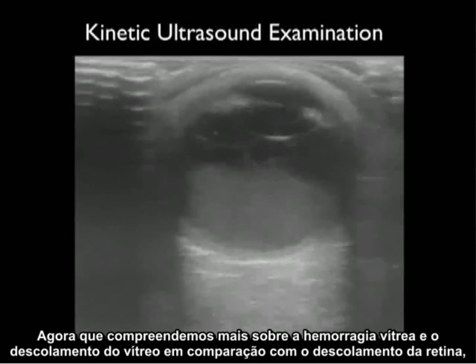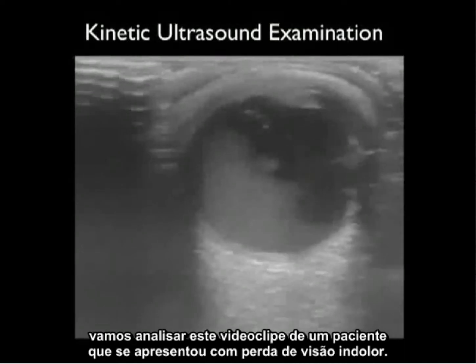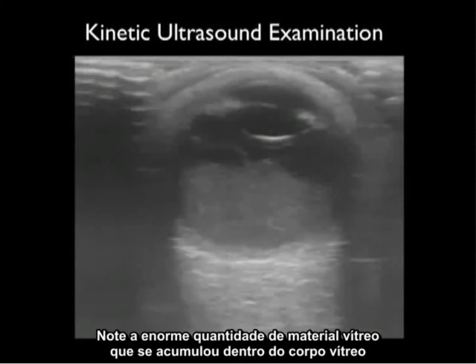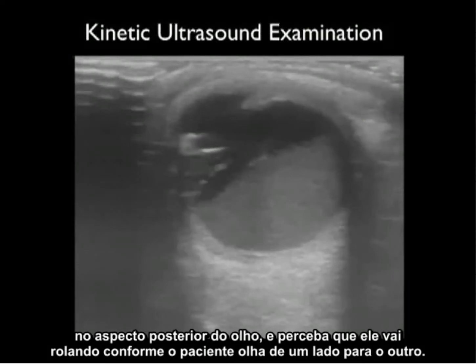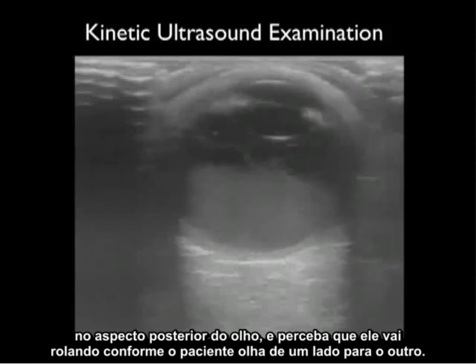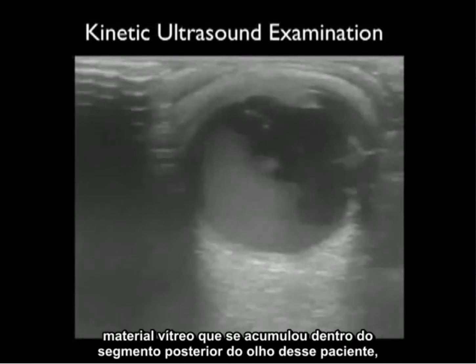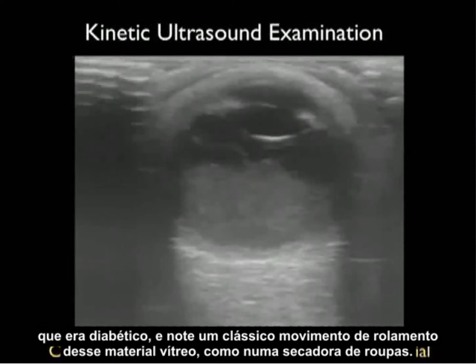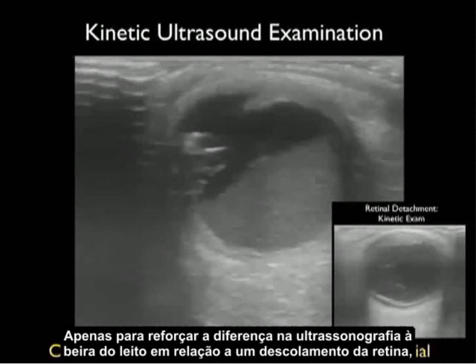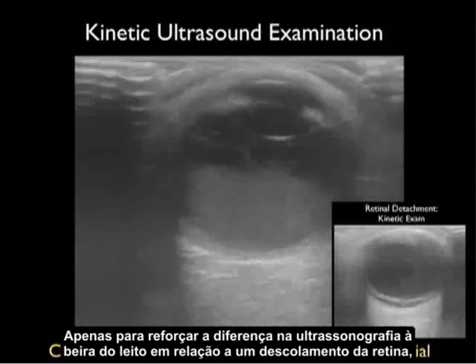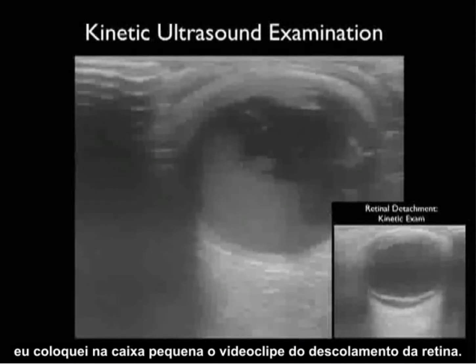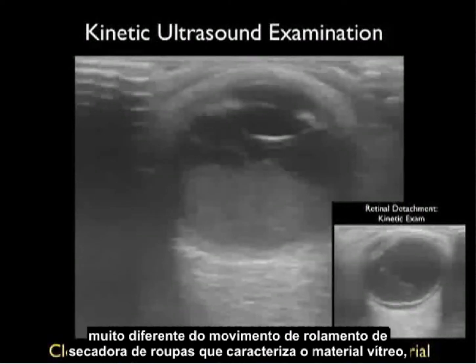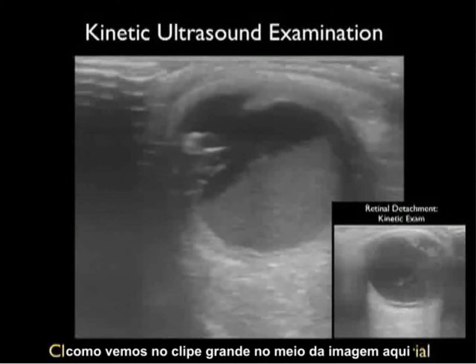Now let's look at this video clip from a patient who presented with painless loss of vision. Note the huge amount of vitreous material accumulated within the vitreous body, and notice that it tumbles around as the patient looks from side to side. This was a large amount of vitreous hemorrhage in a diabetic patient — notice the classic clothes-dryer tumbling motion. In the small inset box, a retinal detachment clip shows the tethered membrane appearance by comparison, which is very different from the tumbling motion of the vitreous material seen in the main clip.